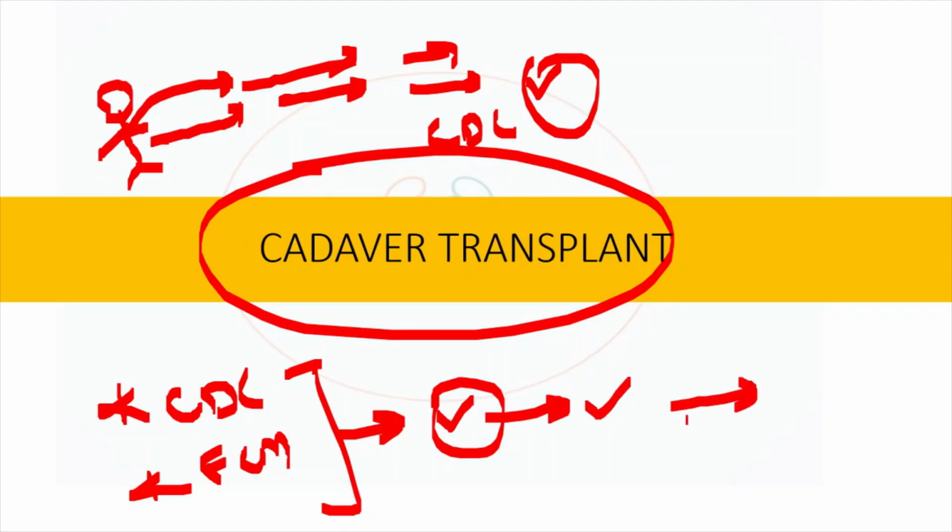So flow cross match is not compulsory, but for a live transplant to be on the safer side, you have to do this. At least a double check is required. CDC is the first check. The second check can be this one or the Luminex or the single antigen bead assays that I will discuss later. I hope till here you have understood flow cytometry in simple terms.